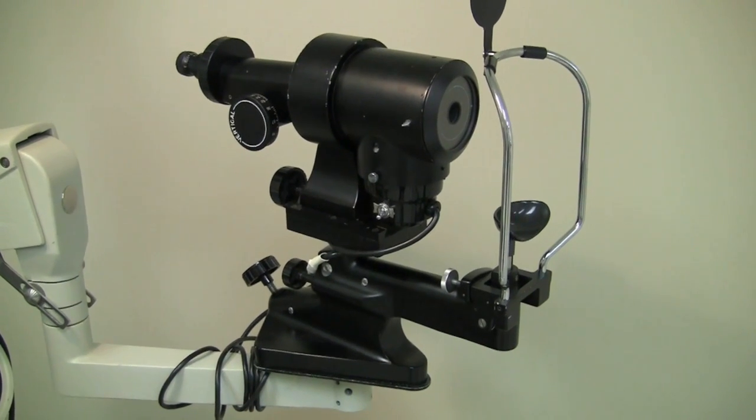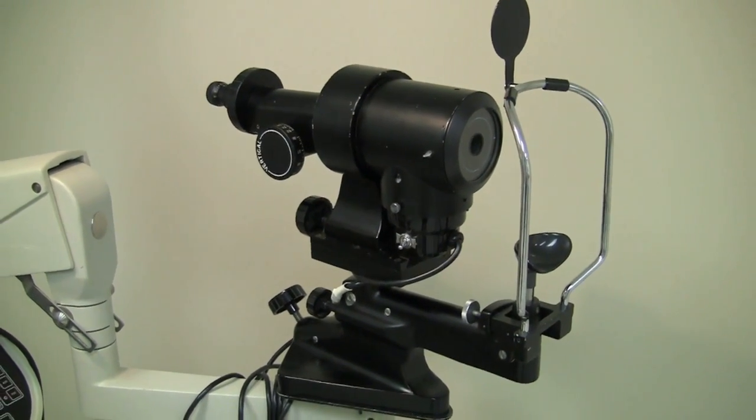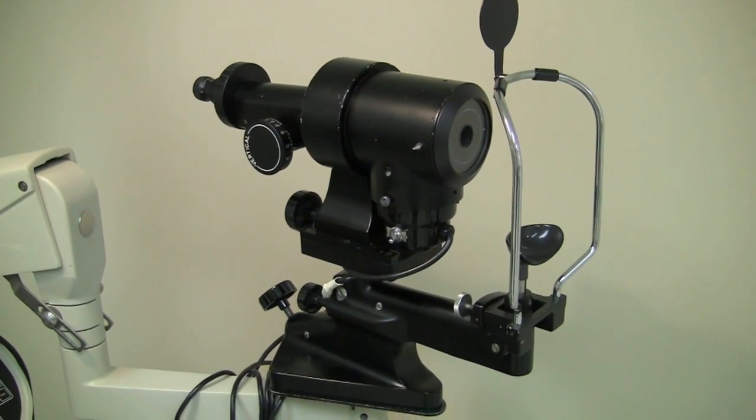As you've been learning about in theory and methods, this is a keratometer. It's used to measure the radius of curvature of the cornea, which we use to indirectly figure out the power of the cornea.